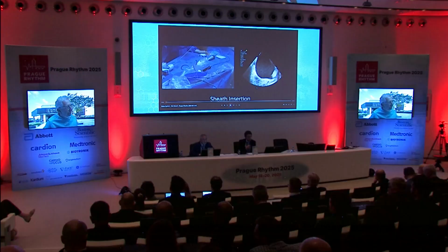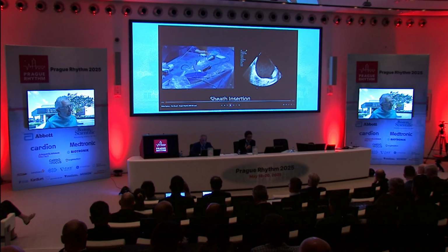Peter, it's Paul Gould. A very impressive case that flowed really very well. How did you know there was a right middle vein? Had you done a CT beforehand? And how do you set the veins up? I am afraid that we haven't had any CT.